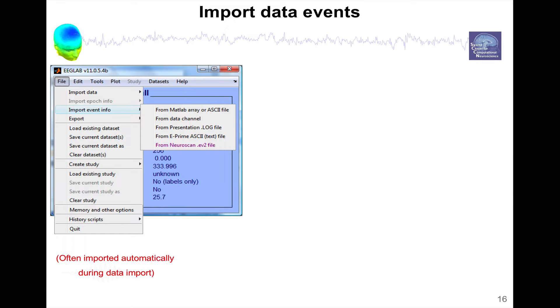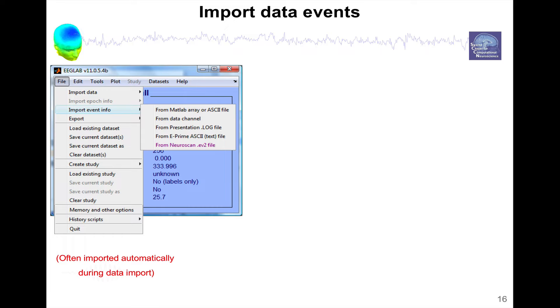Most of the time, event information is already with your EEG dataset. It's been collected using an additional channel, depends on the amplifier, but most often you have some information about events already. Sometimes this information is in an additional channel and then has not been extracted from that channel.